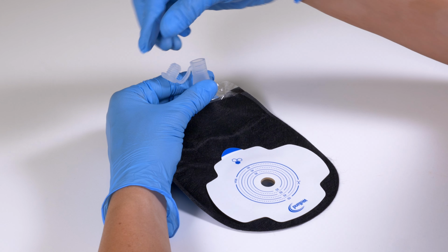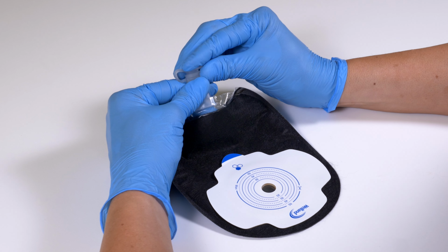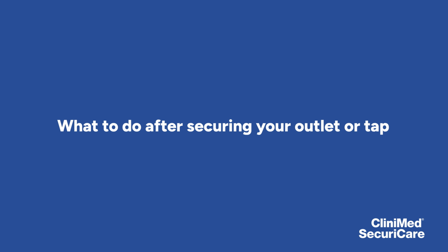Dry the tap with toilet paper, then turn it upwards again. Hold some paper underneath to catch any drips. Finally, press the bung firmly into place to make sure it's secure. Once you've emptied your pouch, dispose of any used tissue and always remember to wash your hands thoroughly.